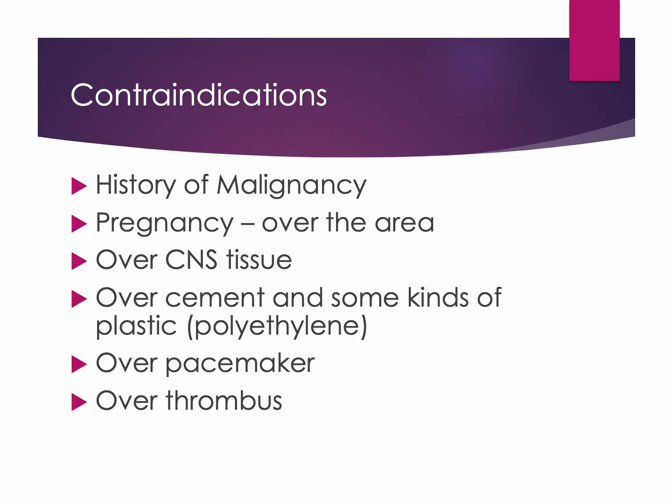Thermal ultrasound also has several important contraindications and precautions that clinicians must understand to ensure patient safety. One contraindication is a history of malignancy or applying ultrasound directly over an active cancerous region. Because thermal ultrasound increases blood flow and cellular activity, there is concern that it could potentially stimulate tumor growth or spread malignant cells. For this reason, ultrasound is generally avoided directly over areas of known malignancy.